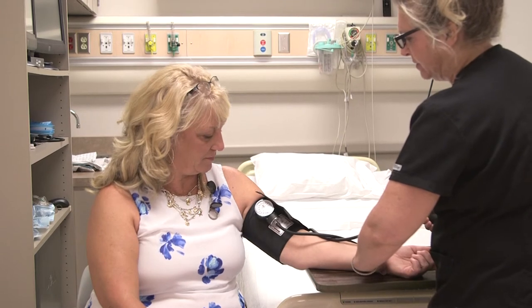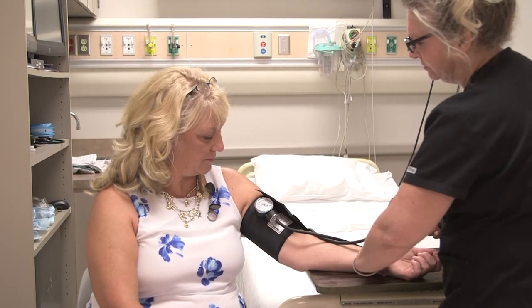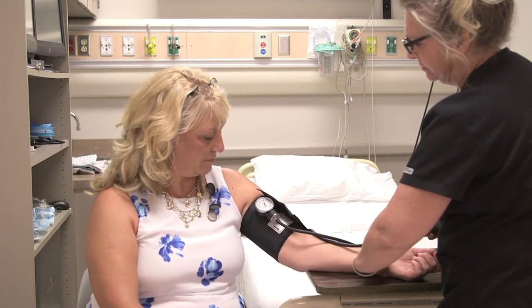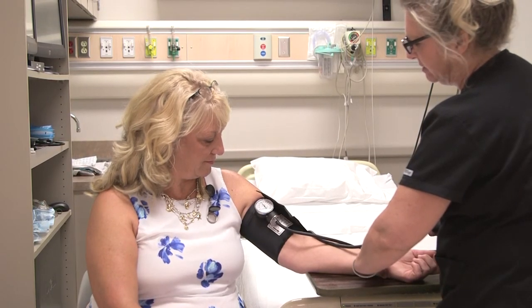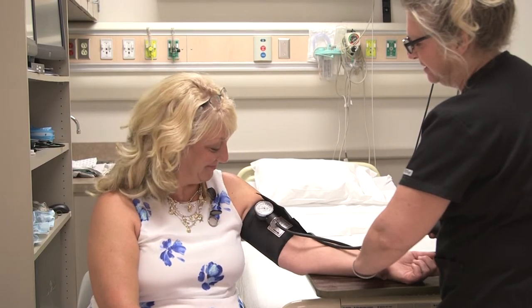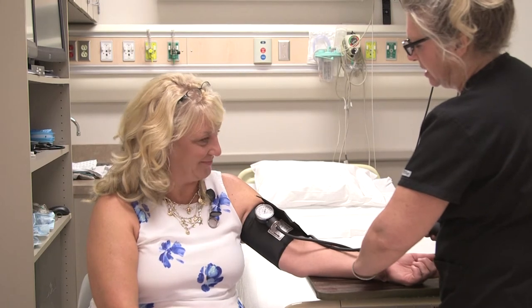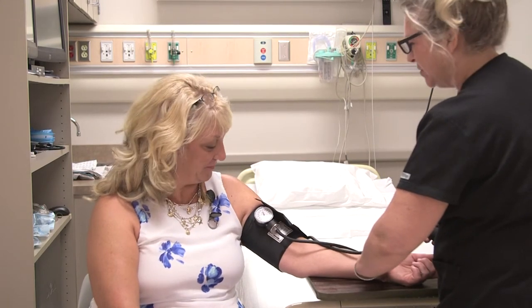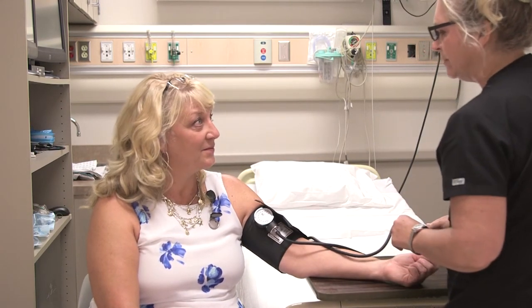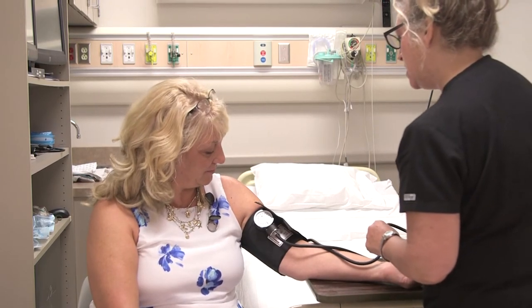So I'm going to go ahead and pump this up — you're going to feel a little tightness. I'm just going to let the air out here and release. So when I checked where your blood pressure should normally be running, it's about — I'm going to pump it up to about 150. I felt your pulse at 120.